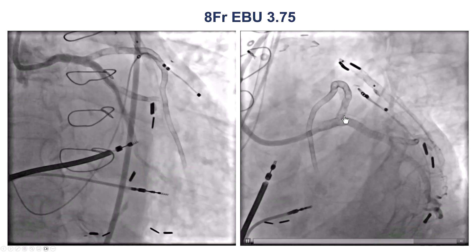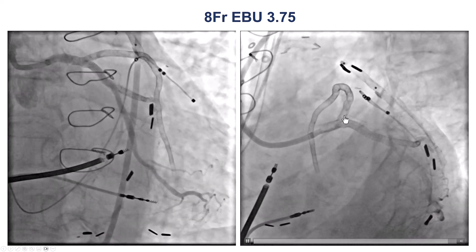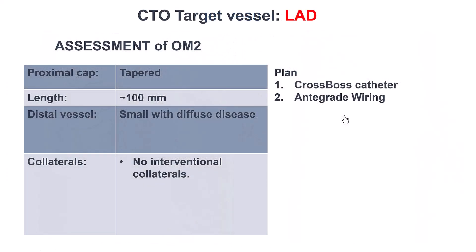You can see it's an ostial occlusion. There's maybe some contrast entry into the LAD. So we have an entry into the vessel. The length is long, the full stent is occluded, the distal vessel is small, and there are no interventional collaterals.